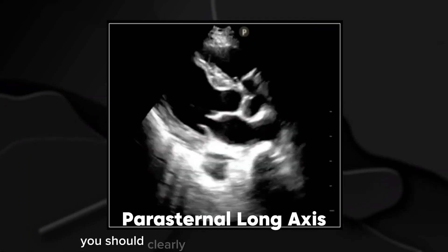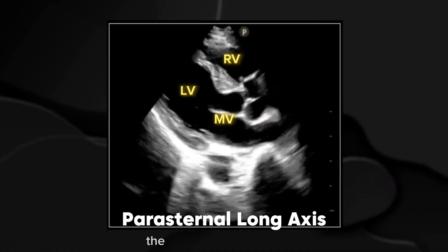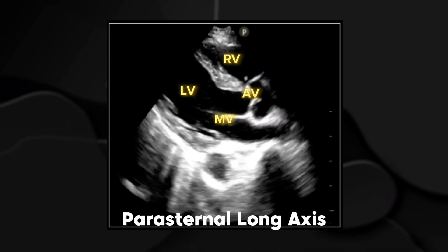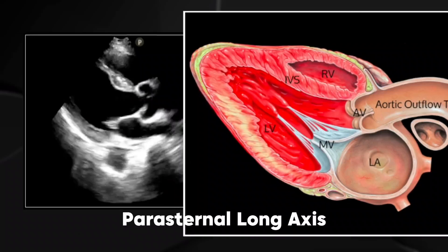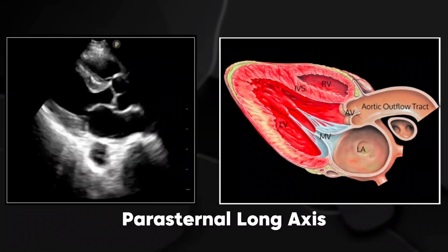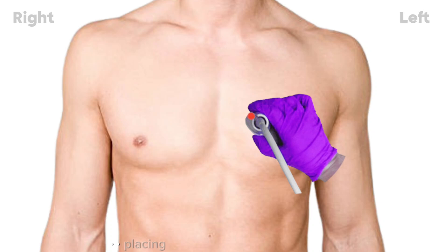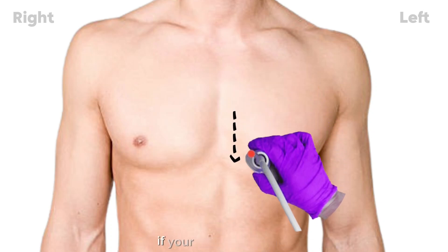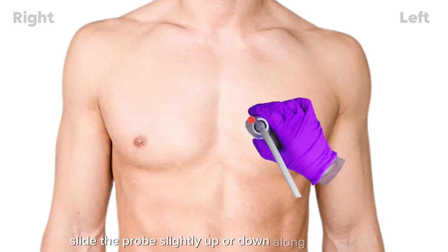In this view, you should clearly see the left and right ventricles, the mitral and aortic valves, and the left atrium and aortic root. Common mistake: placing the probe too high or too low. If your image isn't clear, slide the probe slightly up or down along the sternum until you get the best view.